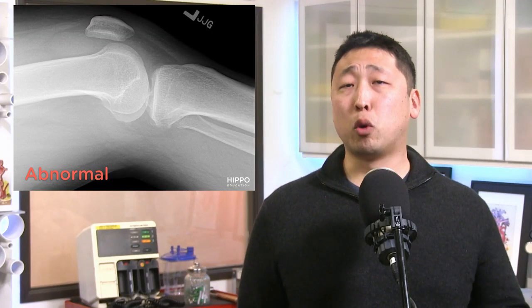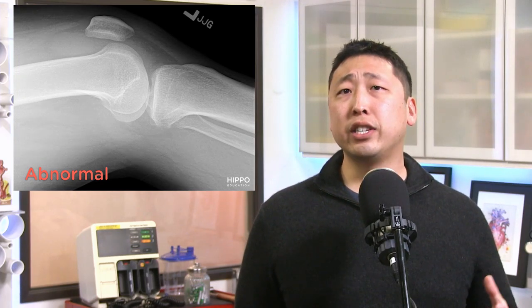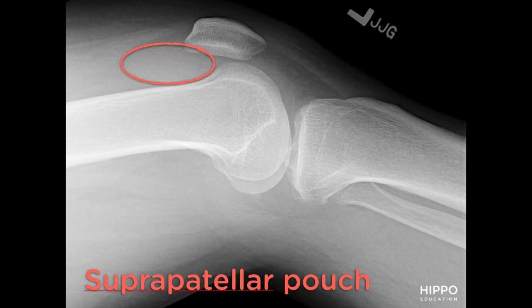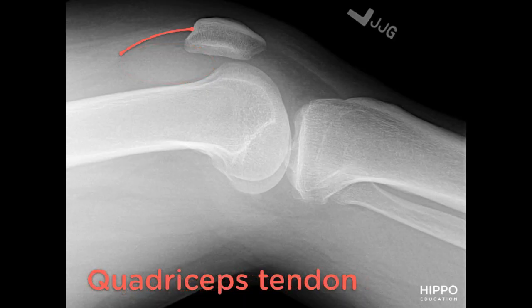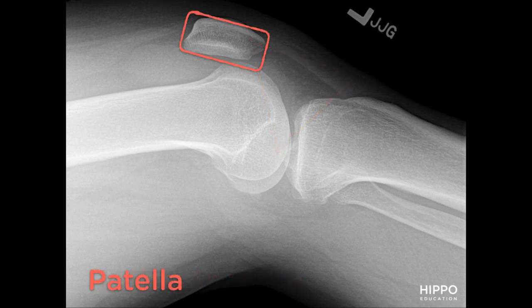Now let's look at an abnormal lateral knee x-ray. In knee effusions, you'll often see a homogeneous rounded soft tissue fluid density in the suprapatellar pouch. Depending on the severity of the knee effusion, you may see bowing of the quadriceps tendon as well as blurring of its posterior border. You may also see fluid density in Hoffa's triangle, as you can see here, and the patella may be anteriorly displaced.